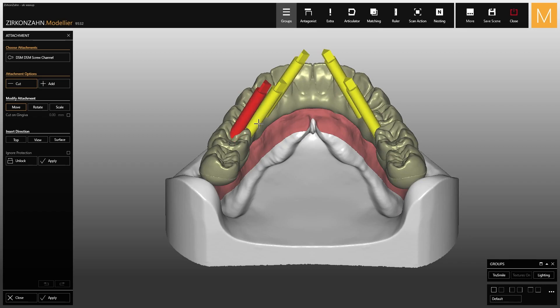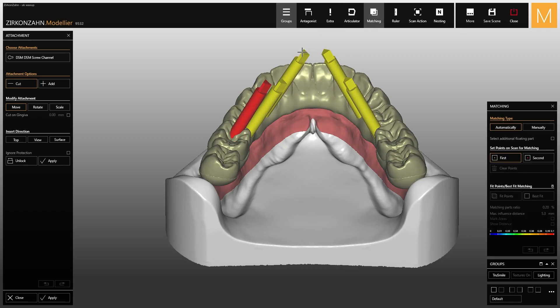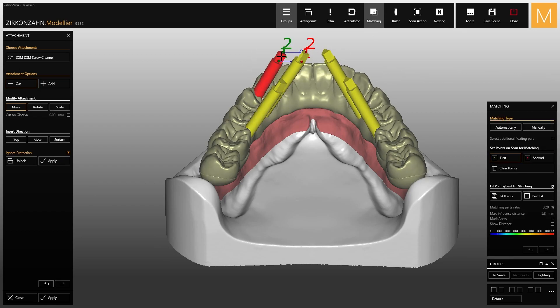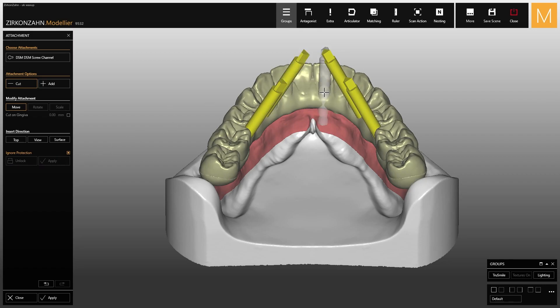Use the matching function to precisely match the attachment to the visualizer. Make sure the function on the left is selected in order to allow any changes and ignore all protections, for example minimum thickness. Then click on apply. Repeat the same steps for the other attachments and once finished, select apply.